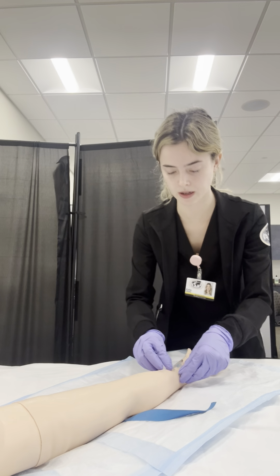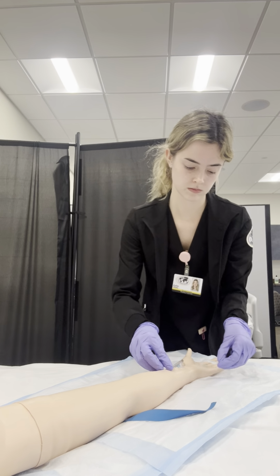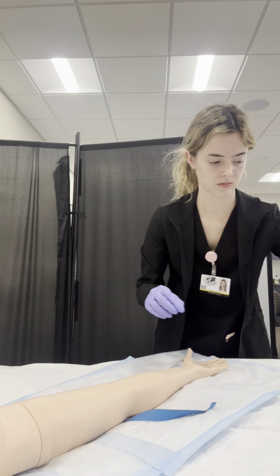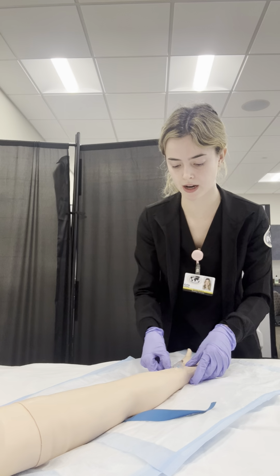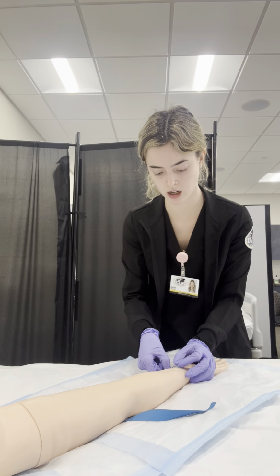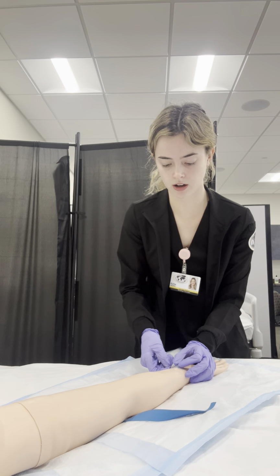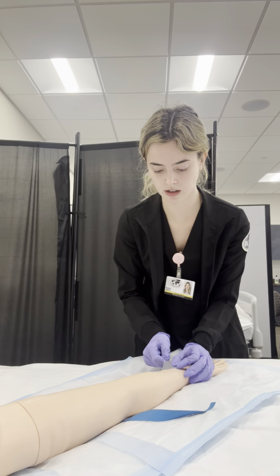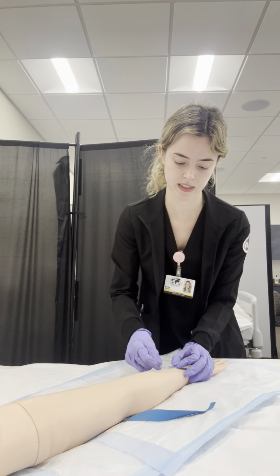Okay, and then I'm going to remove the label. And then I'm going to start removing the dressing, and I'm going to do this by stabilizing the catheter and pulling outward, letting air get in under that transparent dressing, and loosening it up from the skin.